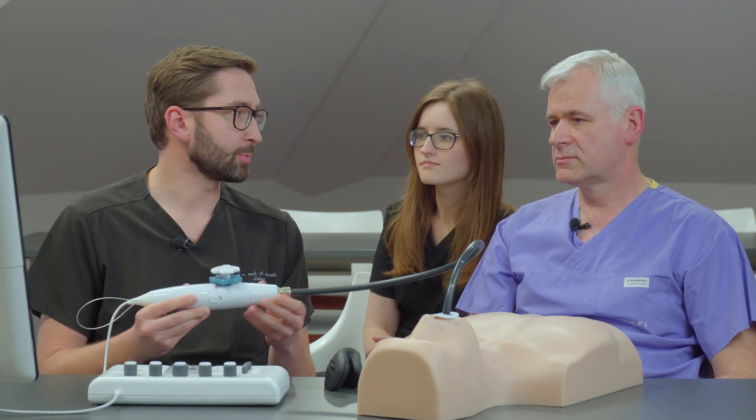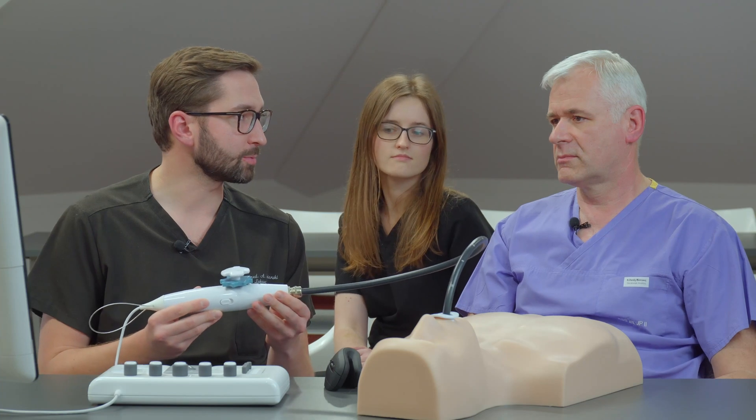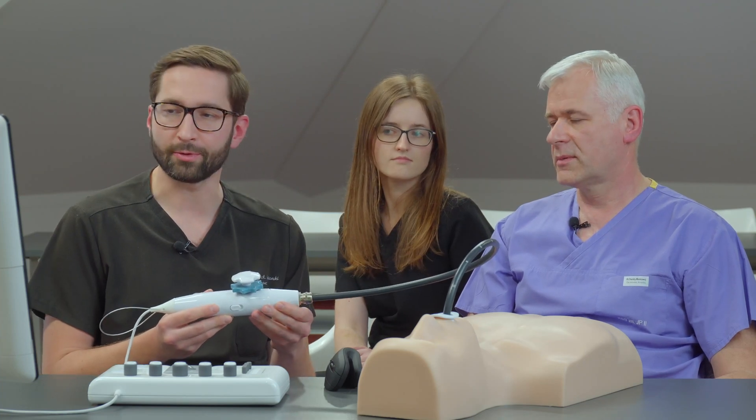Now I can manipulate the probe. Can you explain how you do the real transesophageal echo examination? What do we have to do first, and what are the steps that we follow?